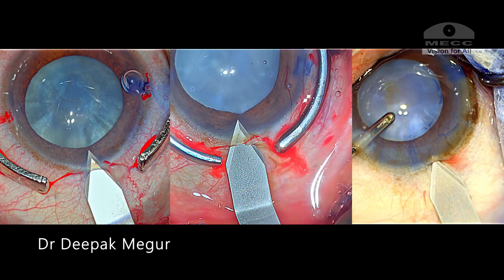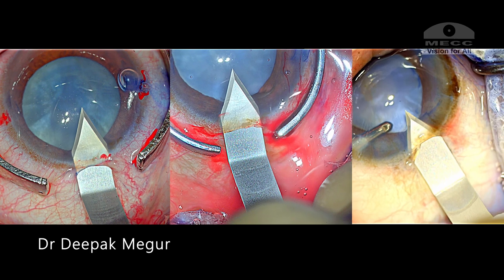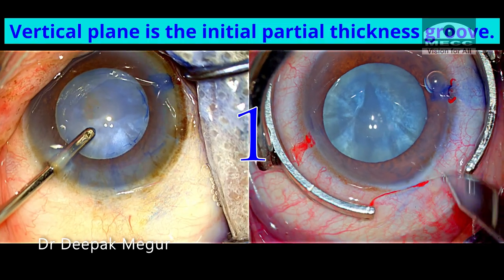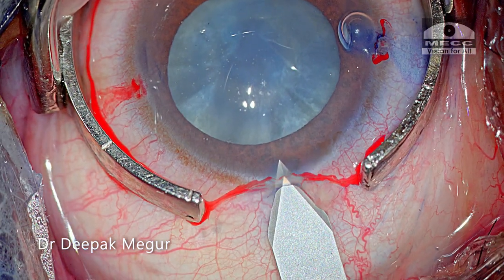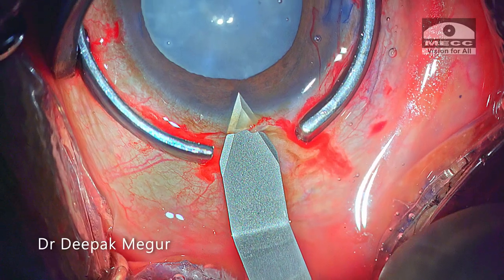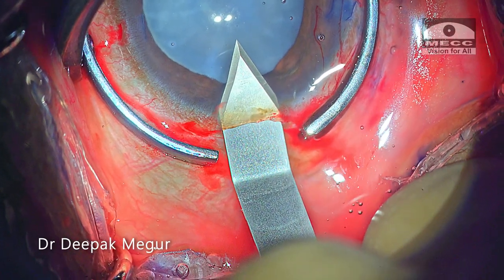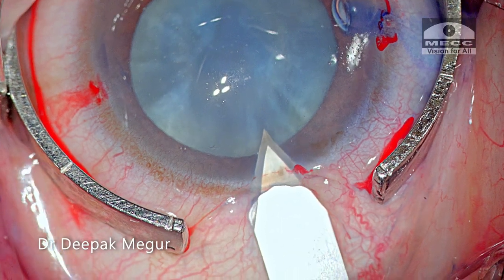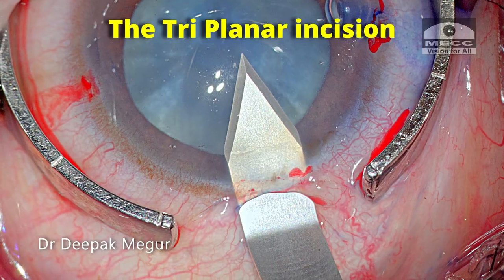In all these cases, we need to note that there were three different planes at which we were working. First, there is an initial vertical groove, then the intracorneal tunnel, and then there is a slight change in plane to bring the blade parallel to the iris before perforating Descemet's membrane and entering the anterior chamber. This is the classical triplanar incision.